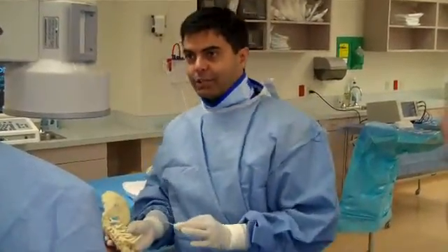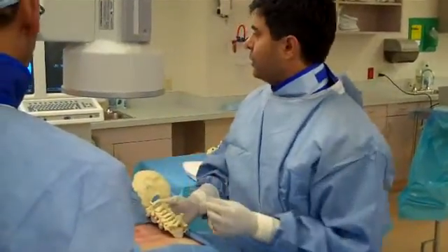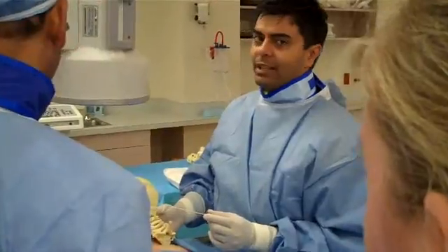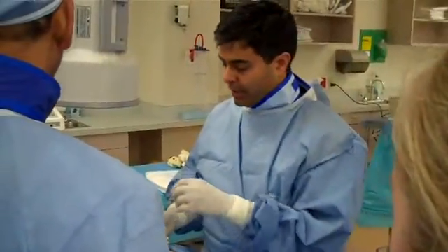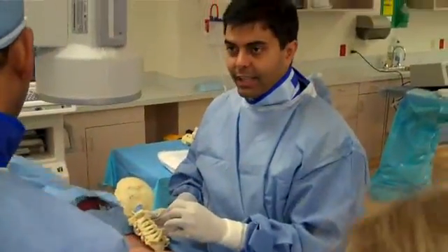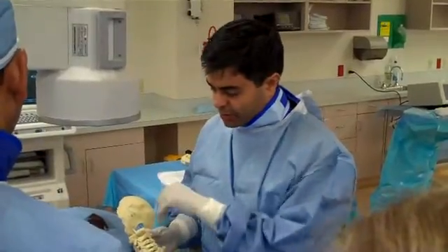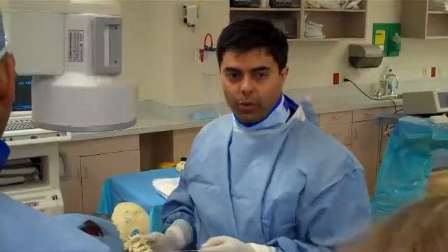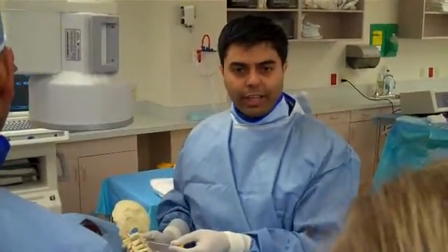The key thing — and this is very important — is that when you're looking at this image over there, it looks like a pretty bad image; it doesn't look that clear. The very first thing you want to do is tilt your C-arm enough in order to see those facet joints. Until you see those actual facet joints, you really don't want to be working your needles. You can be looking at overlapping joints, overlocking bone in an arthritic picture.